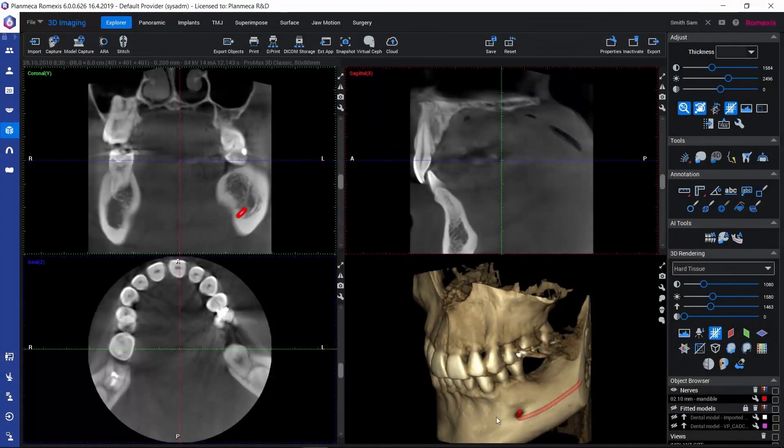Would you like to convert this 3D volume or a part of it to a surface model in STL format, so that you could for example 3D print it? Let's see how that works.